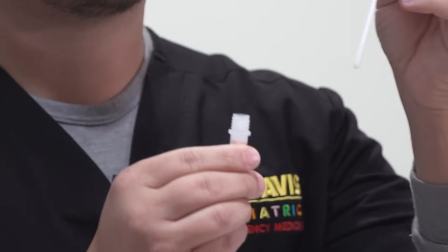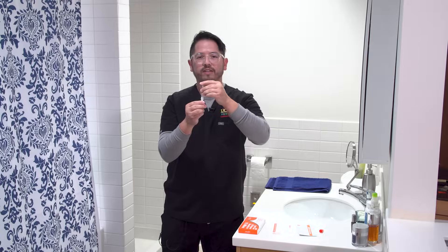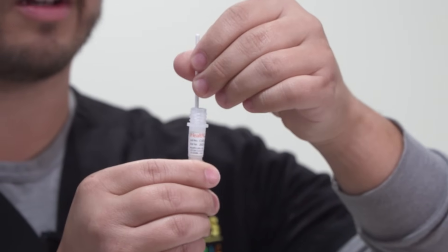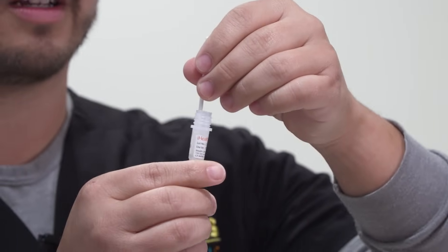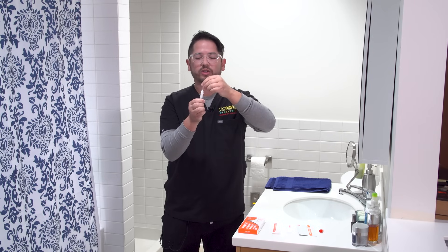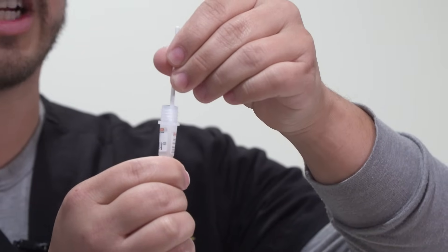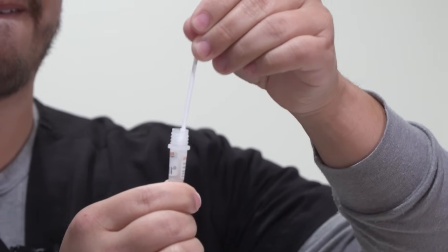Place the swab into the liquid and you're going to turn 15 times. One, two, 13, 14, 15. Next is the crucial part. You're going to squeeze the bottom in order to squeeze the swab as you pull out, making sure you get every last bit of the collection. Now you can throw away your swab.